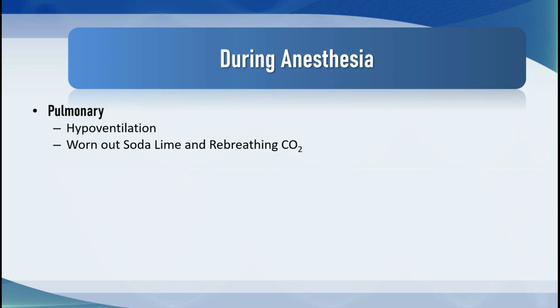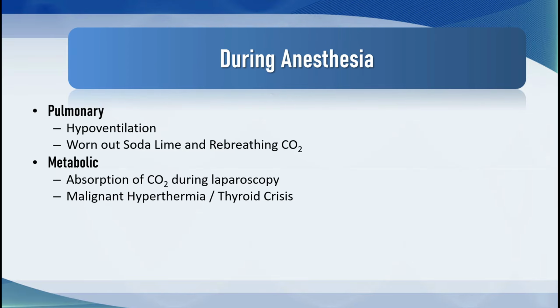Occasionally, the patient may rebreathe carbon dioxide because the soda lime has worn out and the flow rates are too low. In this particular patient's case, the CO2 that was entering the body through the peritoneum was being absorbed and it was increasing the partial pressure of CO2 in blood, and as a consequence the end tidal was increasing.